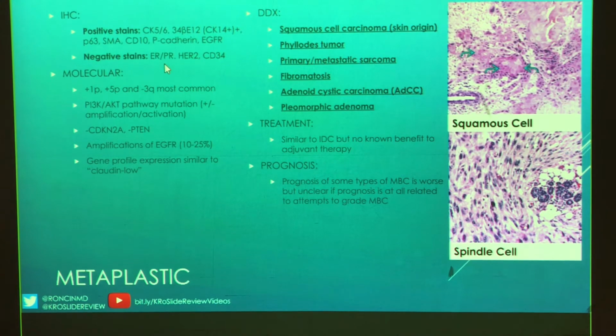They're a metaplastic lesion that's occurring in the breast. They're going to have the triple negative phenotype, so they're going to be hormone receptor negative, HER2 receptor negative. So if you did a MammaPrint on them, or an Oncotype DX or whatever, these are going to fall under the same realm as your triple negative breast cancers.